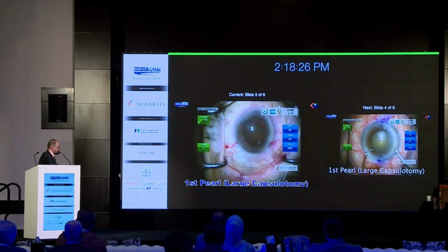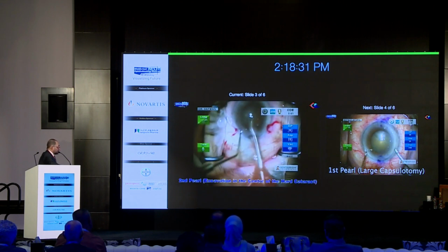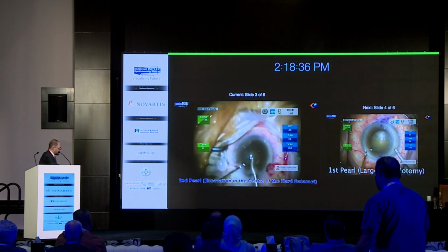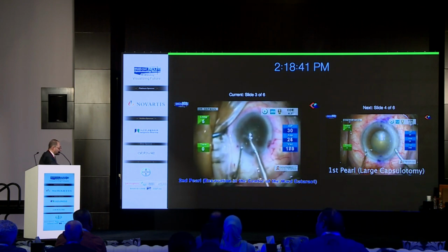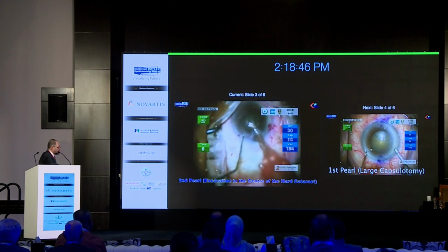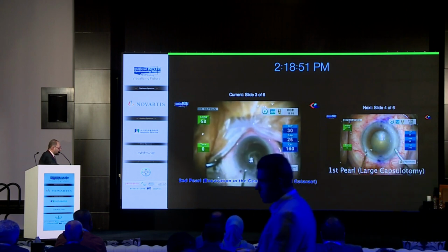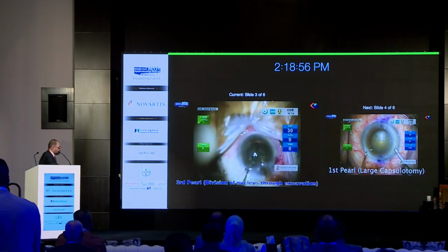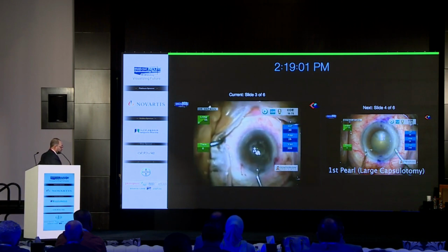So I finished the capsulorhexis, and the second step is the pre-chop if they have one, so I'm removing the pre-lens and I start here to excavate. The excavation, 70% of the lens, in the center, leaving the margin. Definitely the lens is very hard, and you can see I'm reaching up, down. This is almost the cataract nigra. Then divide. This division, the vertical division, through and through.